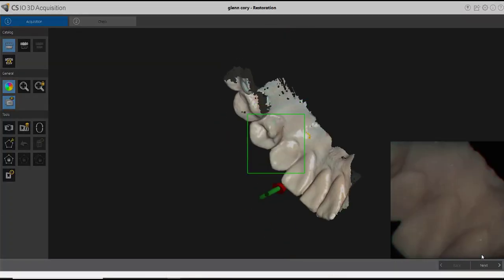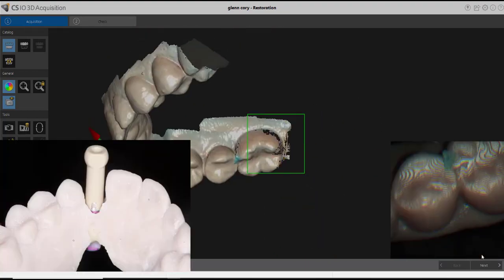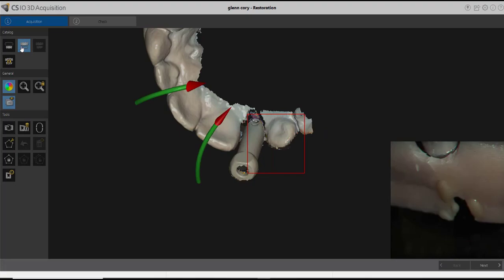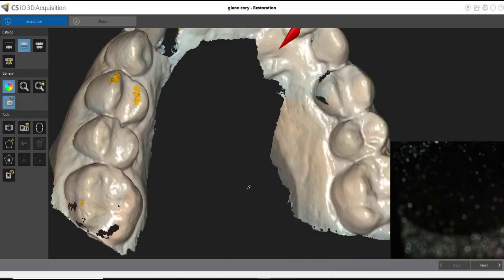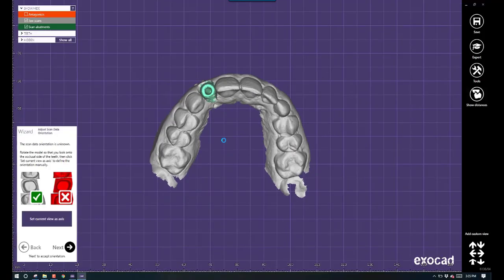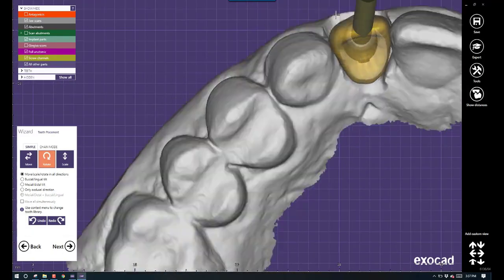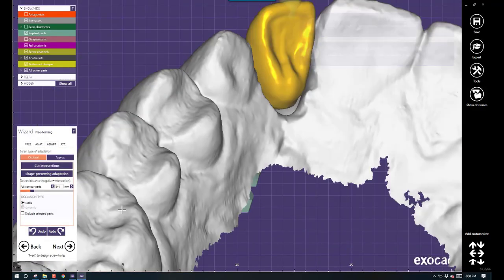With that working model, I put a scan body onto it — the kind that just slides over a tie base — and I'm using the Carestream 3600 intraoral scanner to scan my model, giving me a digital working model. We could have done this all digitally without a real working model if this hadn't been an angled tie base. You can then take that digital model into Exocad, Blue Sky Plan, or 3Shape and design it just as if it were a normal tie base restoration.